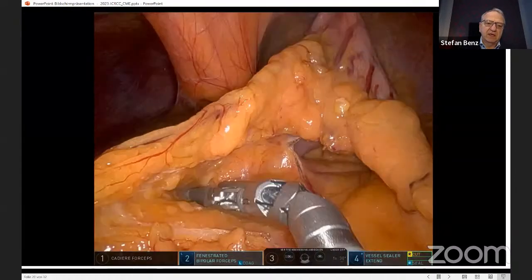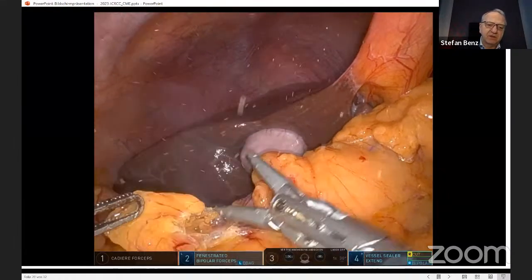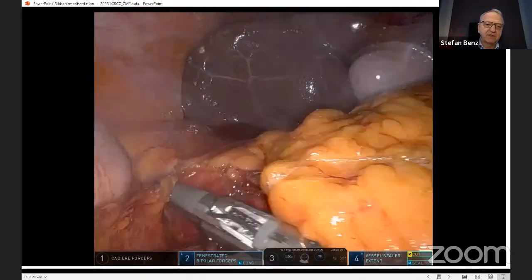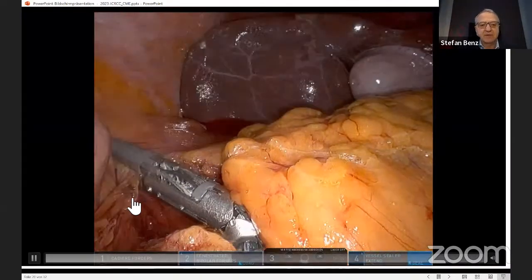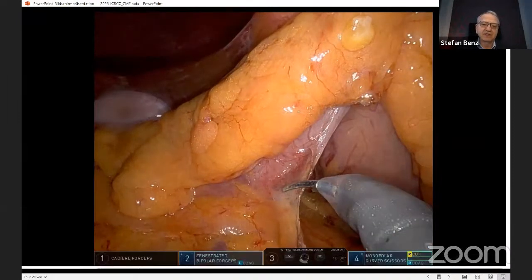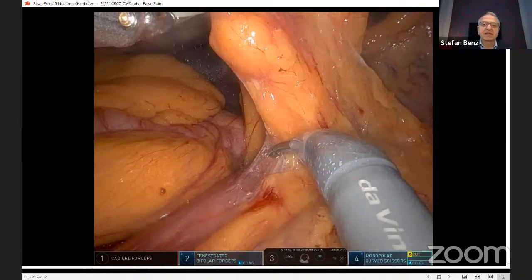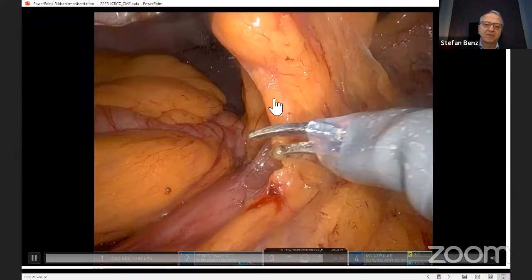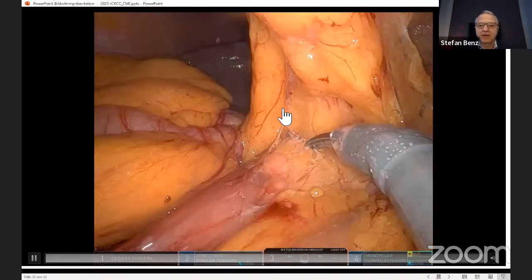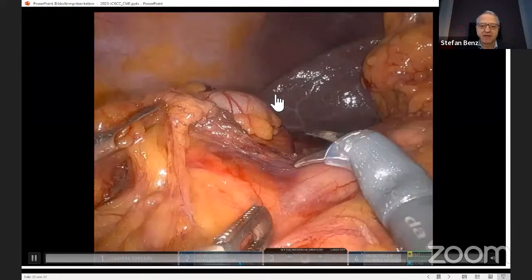So we separate, as Professor Lee already pointed out, in an avascular plane, the mesogastric structures from the mesocolic structures. Infrapyloric lymph nodes stay in place. And then we encounter the dissection plane we created dorsally at the hepatic flexure and divide the hepaticocolic ligament. And then the mesogastric fat body on the pancreatic head is dissected away from the pancreas. This is the fat body that contains the gastroepiploic vein.